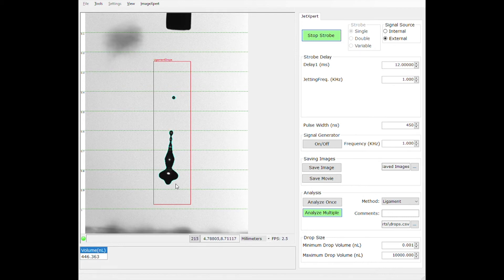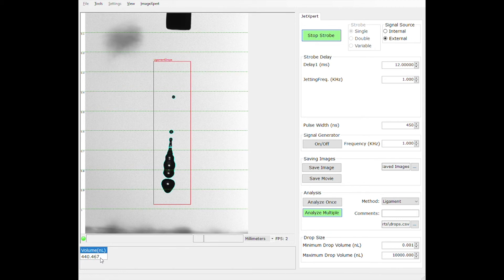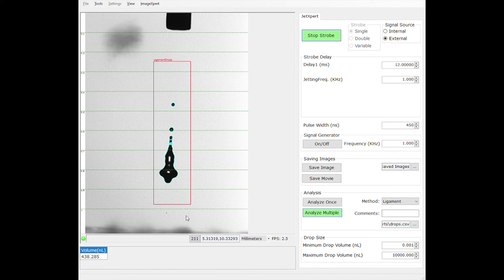All of this data is automatically going into a Microsoft Excel file so that you can track it over time. This data can also be sent to a master computer via TCP/IP if you're interested in automating the verification process in line.